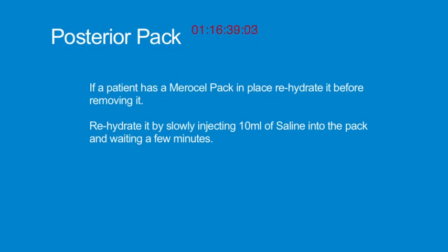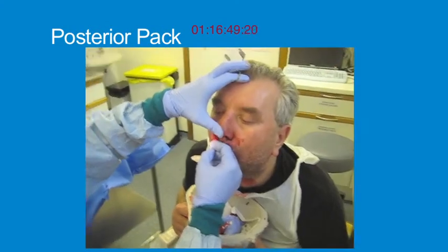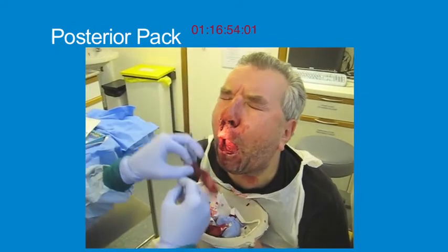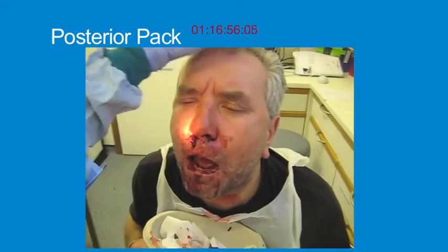If the patient has a Merocel in place, rehydrate it before removing it. Rehydrate it by slowly injecting 10 ml of saline into the pack and then waiting a few minutes. Pull the Merocel out. Remove any clots from within the nasal cavity with suction. Examine the nose again for any bleeding points.